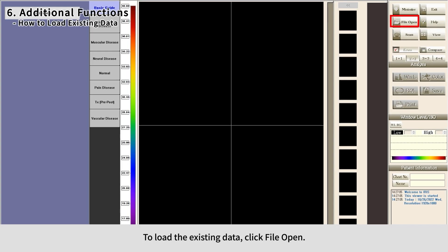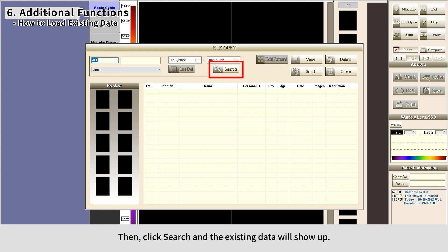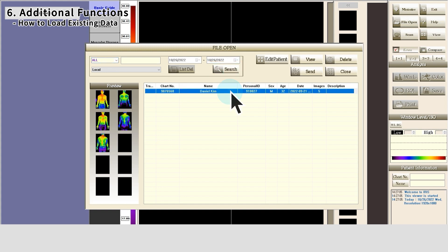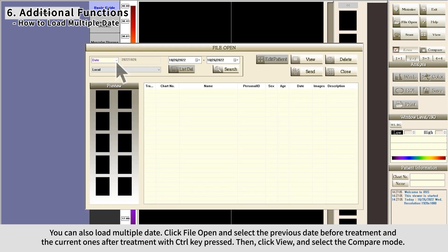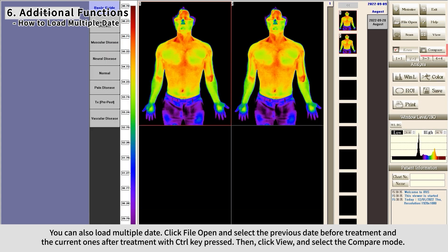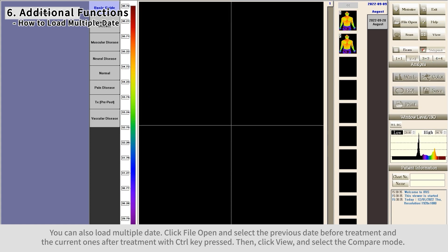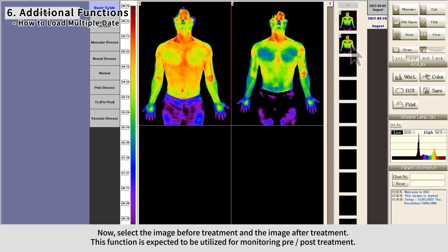To load existing data, click File Open — the File Open window will pop up. Select the category in the top left corner, click Search, and the existing data will appear. Select the data you want to see and click View. You can also load multiple data sets: click File Open, select the previous data before treatment and the current data after treatment with the Control key pressed, then click View and select Compare Mode to compare images before and after treatment. This function is intended for monitoring pre- and post-treatment progress.